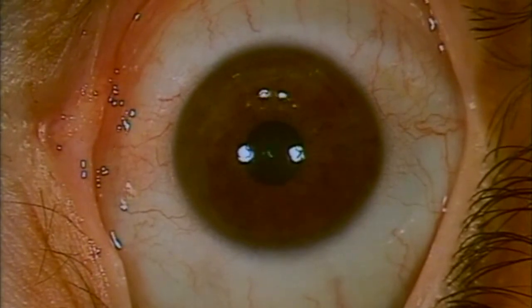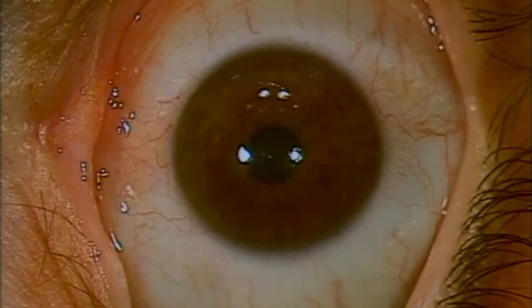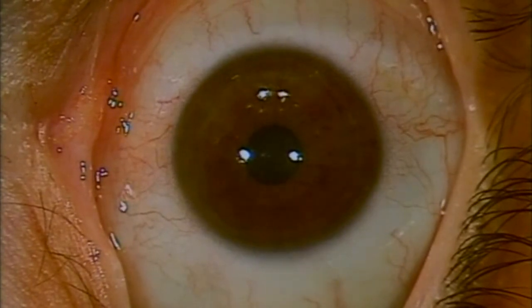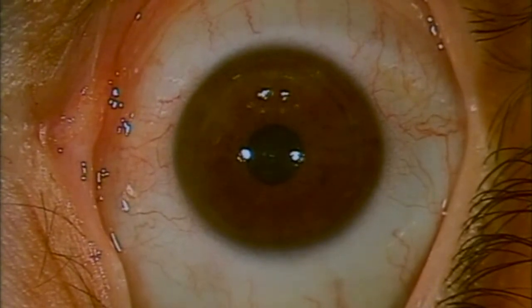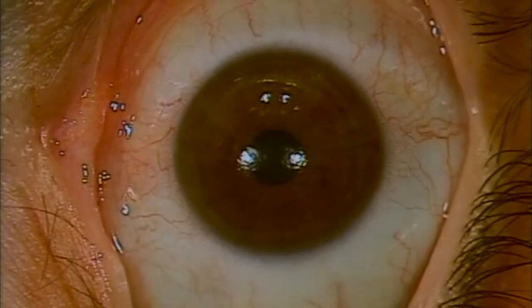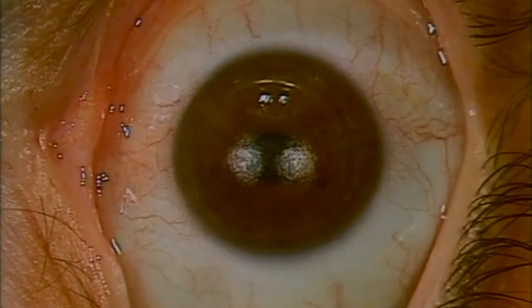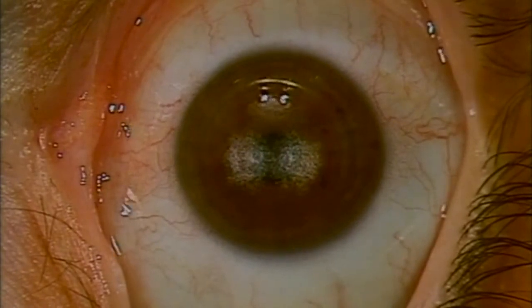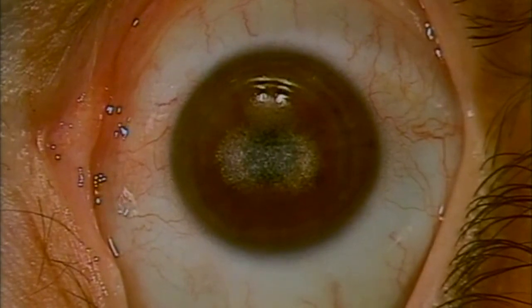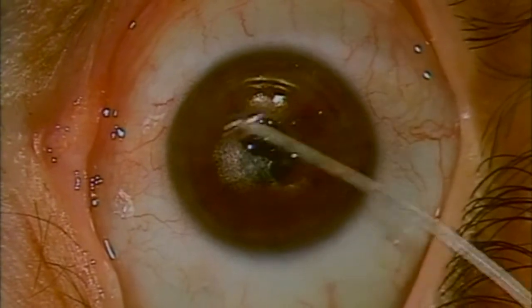You can see the expanding centrifugal spot pattern in the refractive phase of the TransPRK here, which then contracts back into the middle before we start the PTK element. That centrifugal pattern helps to drive fluid to the periphery and minimize the effect of any unevenness in the tear film. But if you can base your technique on obtaining a clean uniform tear interface before you start ablation every time, that will really help you to get consistent results. And there we are at the end of ablation with the super smooth bed produced by the fullerene spot pattern.